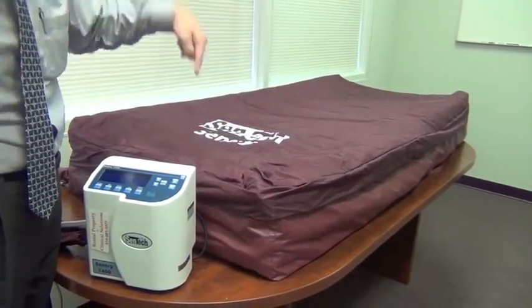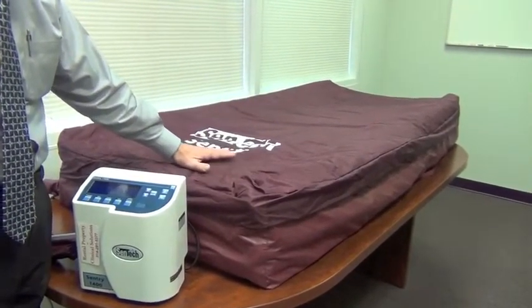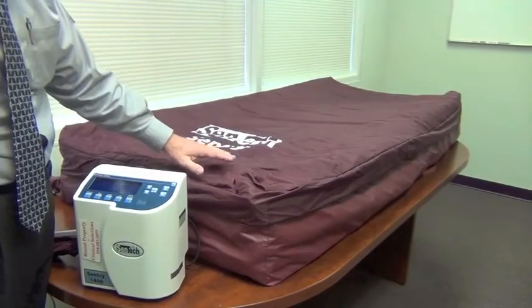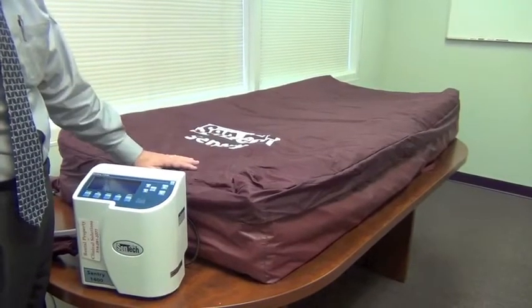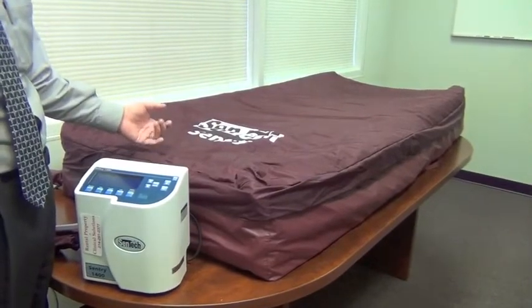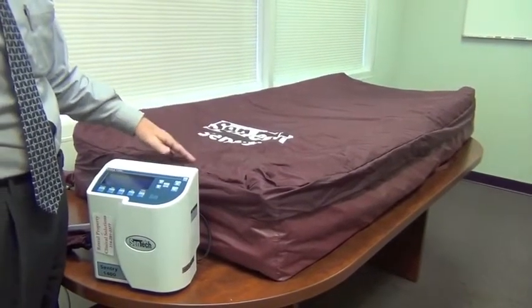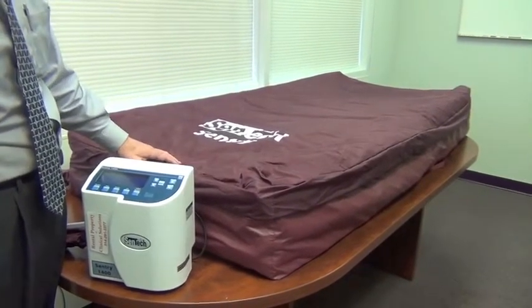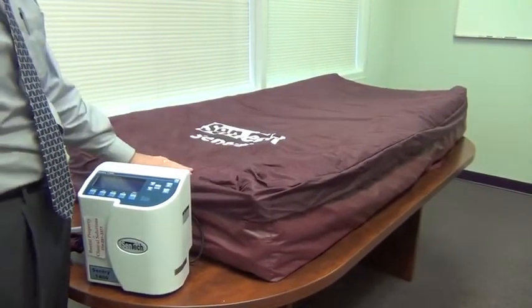So in addition to moving moisture vapor through this urethane coating, we also have direct continuous airflow against the patient's skin when we're using the low air loss feature on the Sentry. And that is one very aggressive means of addressing overhydrated tissue. The downside really of overhydrated tissue is weakening of the tissue, which can result in blistering and can also result in skin tears. The patient is much more at risk of being subjected to the detrimental effects of shear when tissues are overhydrated as well. So if you have a patient that presents with that need, this is one way to address that.